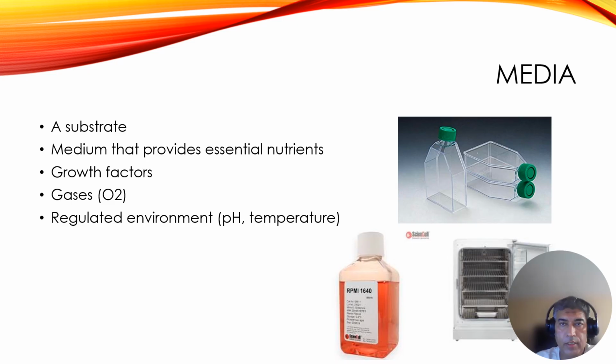As we saw in the earlier slide, what is media? It is a substrate, and it provides essential nutrients, growth factors, gases, especially oxygen, and a regulated environment, including pH and temperature.